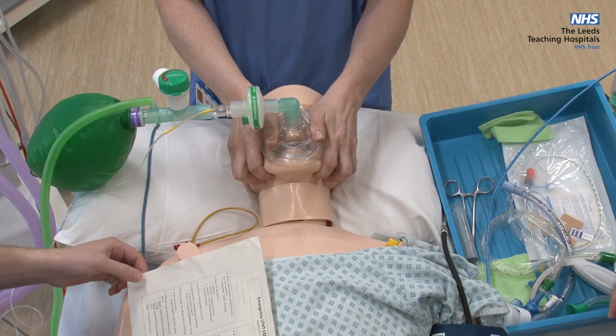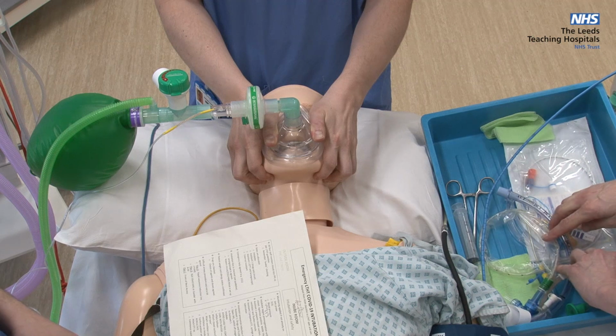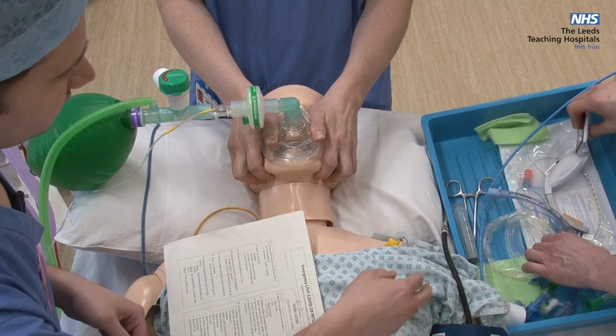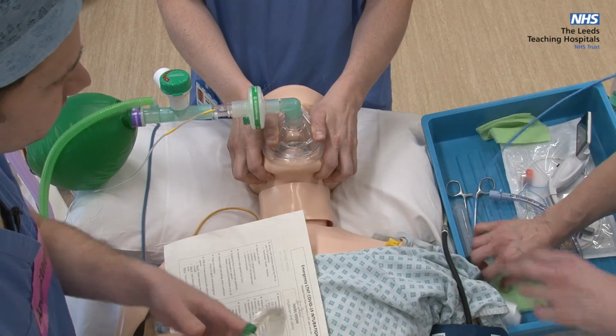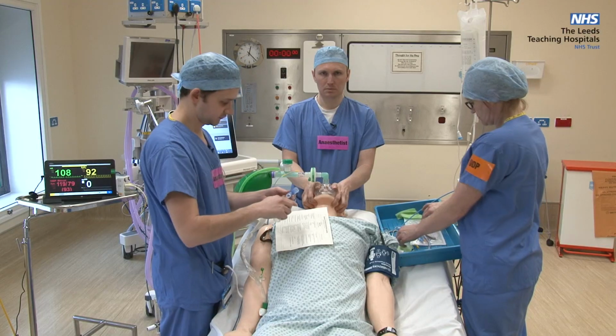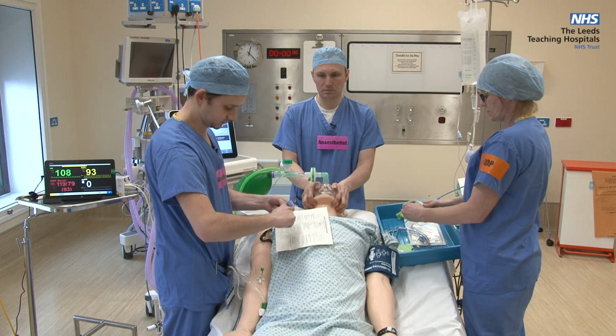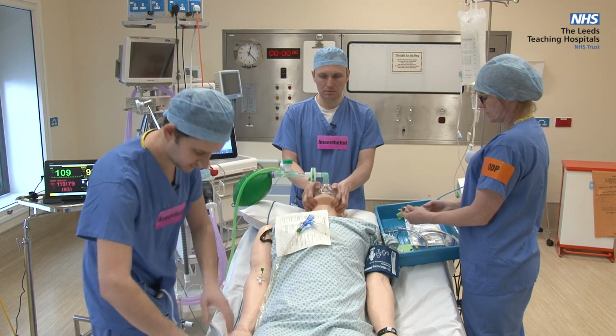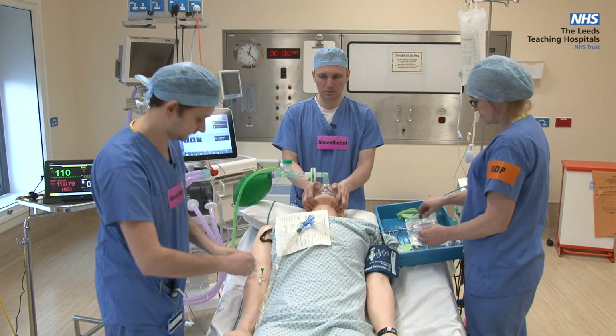At this point, I'm going to prepare the closed circuit suction. Just see if I could have that, please. Ready for use. And I'm going to check that the cannula works with a flush.